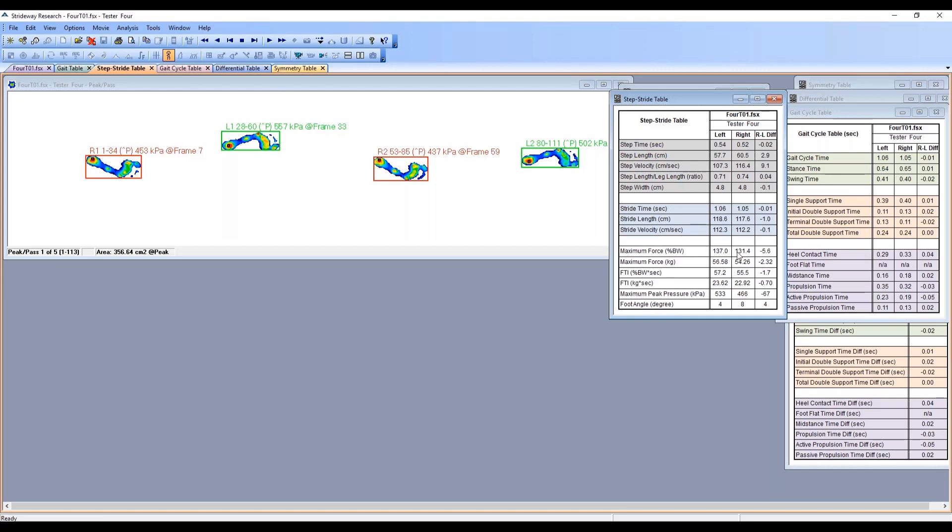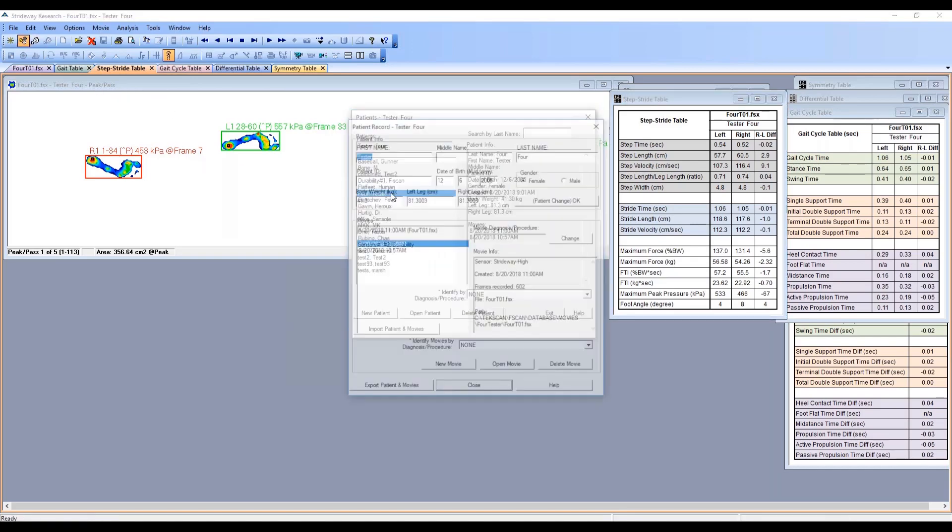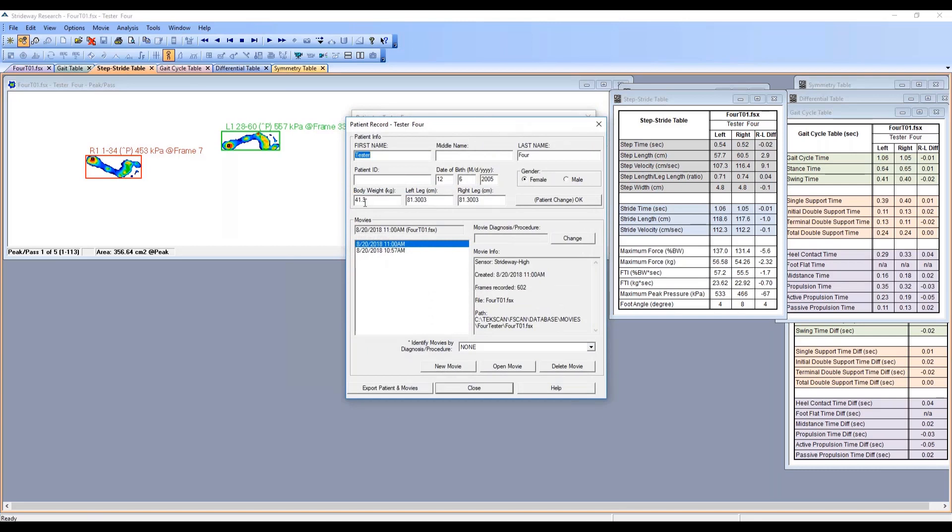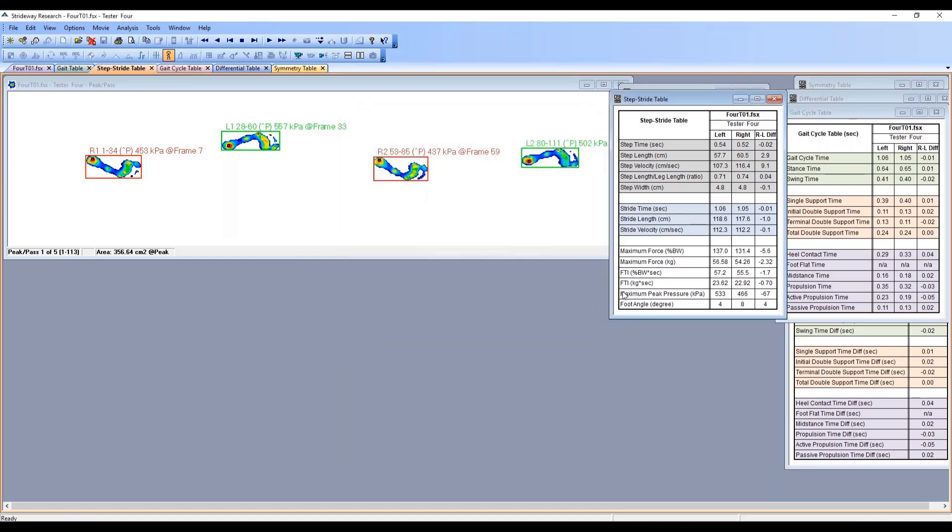The maximum force is down here as a percentage of body weight. In order to get that calculation, you do have to have the body weight inserted into the box, otherwise you will not get a value. Force time integral is also a percentage of body weight. Then we've got our foot angle showing the degrees at which the foot is positioned - a four degree angle versus an eight degree angle.